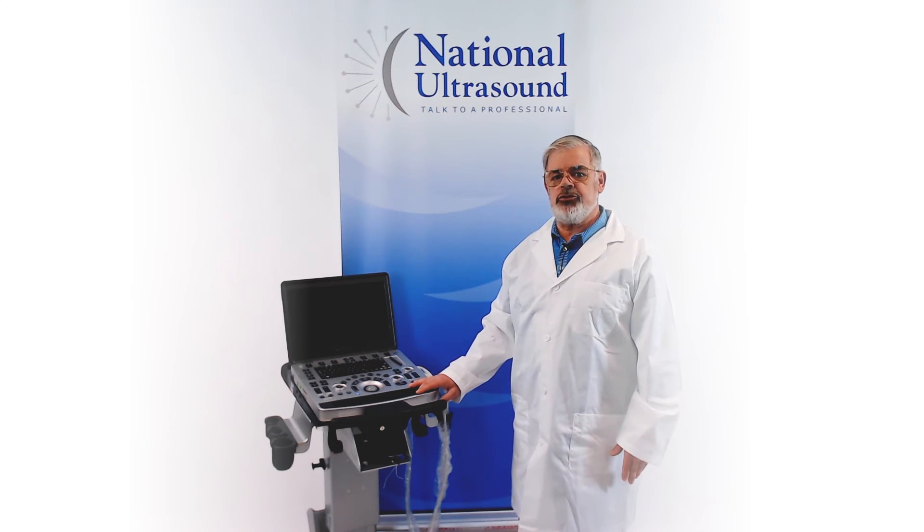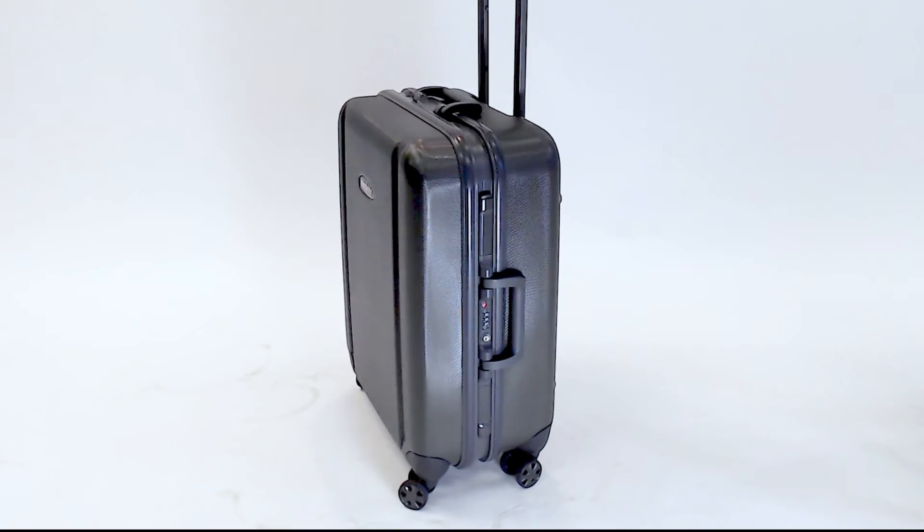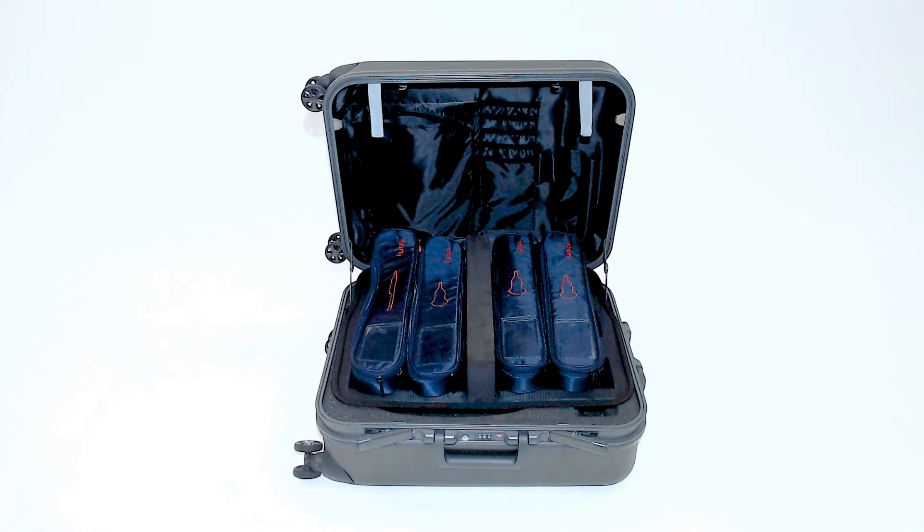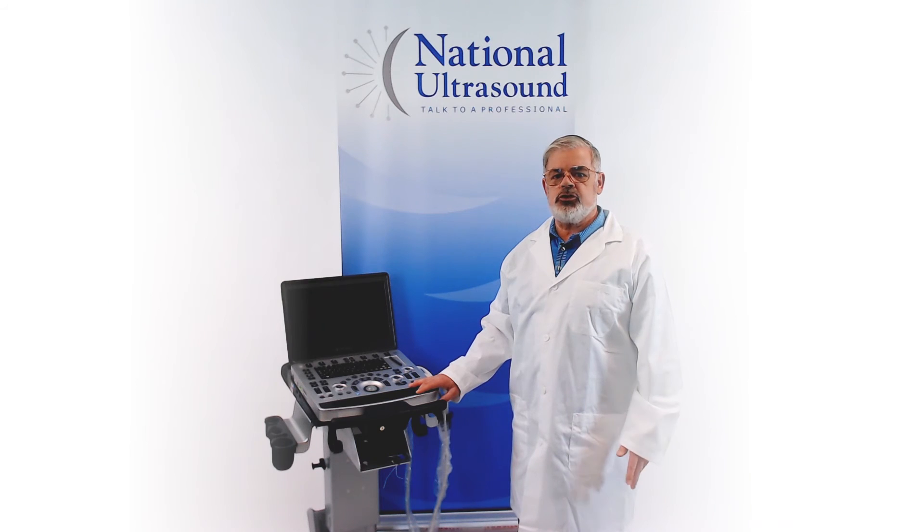Highly focused features make the M9 a perfect system for both abdominal and advanced cardiac imaging. The M9 includes a convenient rolling travel case that can hold up to four probes. With its full suite of transducers, the M9 is a powerful and versatile machine for all applications.